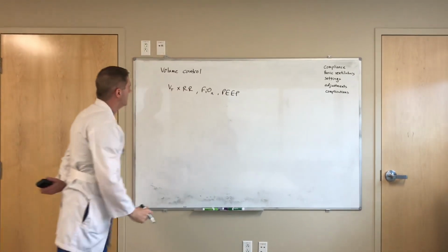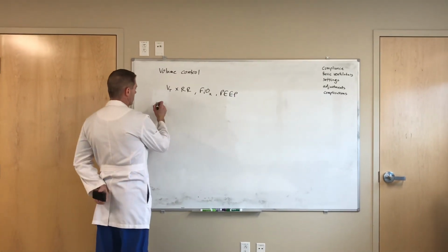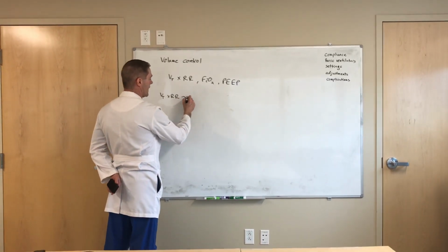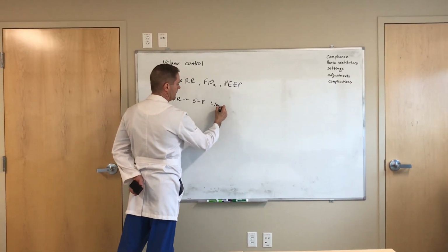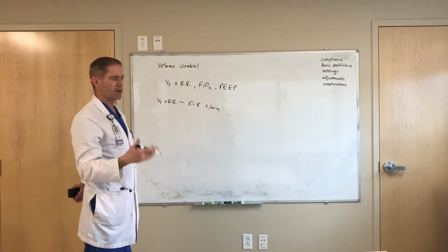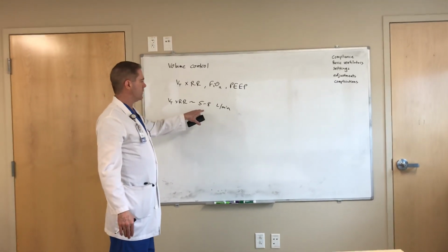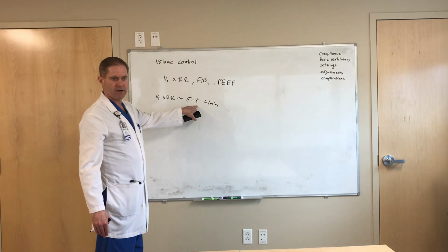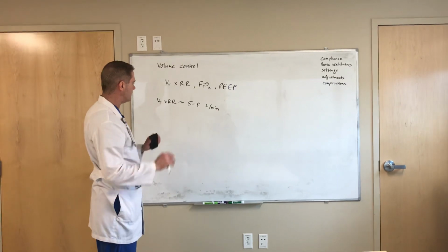Tidal volume we talked about, so based on ideal body weight, figure it out. Most people are going to have a minute ventilation, which is your tidal volume times respiratory rate, somewhere around 5 to 8 liters per minute. If you have a sedated, normal patient who you're intubating because maybe they had a narcotic overdose, you don't need much more than 4 or 5 liters per minute. If you have somebody who's got a lot of lung disease, it may require 8 to 10 liters per minute of ventilation because a small percentage of your ventilation is actually participating in gas exchange. But that you're going to have to assess.